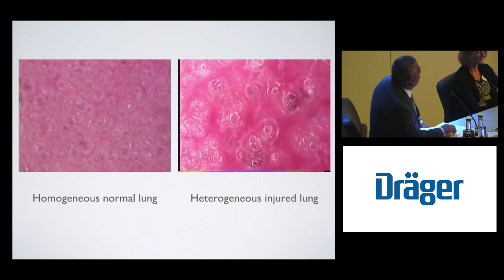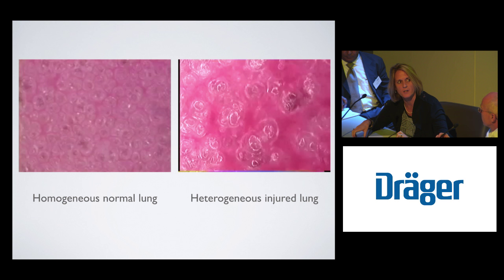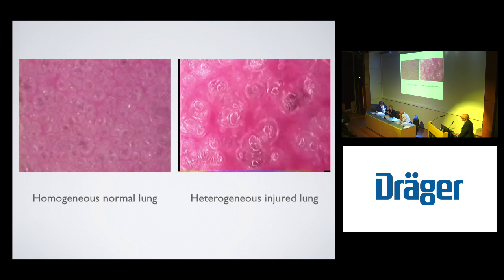Okay, so a couple of things. When we talk about using high airway pressures on APRV, I think it's also important to look at it as mean airway pressure because, as Dr. Habashi has often described, what's the mean airway pressure of the waveform this way or this way? So the mean airway pressure versus driving the pressure in for a short period of time or holding the pressure for a long period of time.